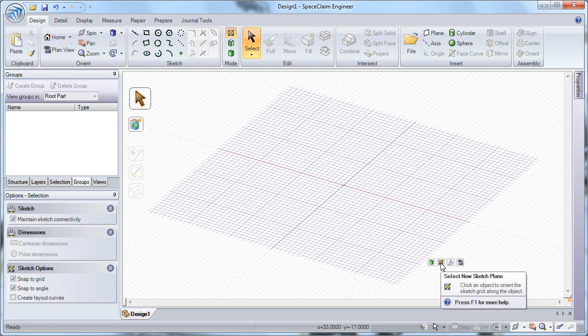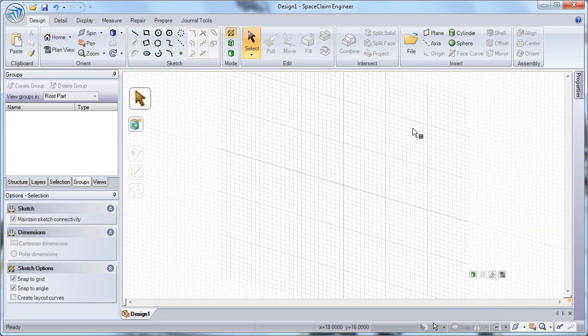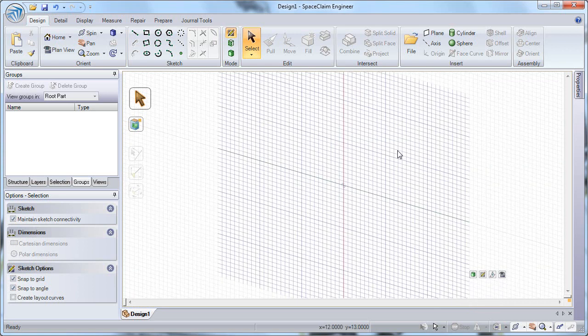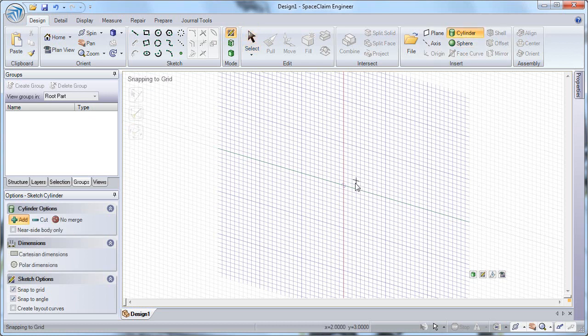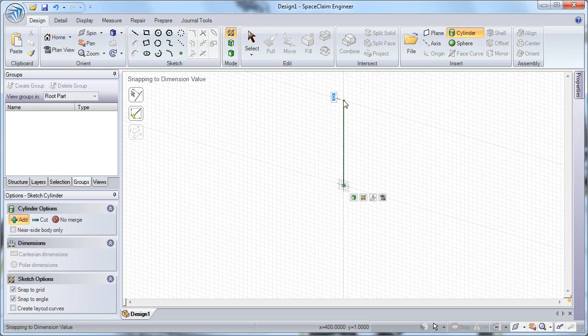The first thing that I'd like to do is to change the orientation of my sketch plane. I'm going to click sketch plane in the tool guide on the bottom right, and you can see that as I hover over my screen I can select a new orientation. Now let's create our first cylinder. I'm going to click the cylinder tool and then create a height, and I can type in a definite value of 400 millimeters, and then I can pull that out to expand it to the diameter that I'd like. We'll give that a rough estimate since we're just looking to get a concept down.